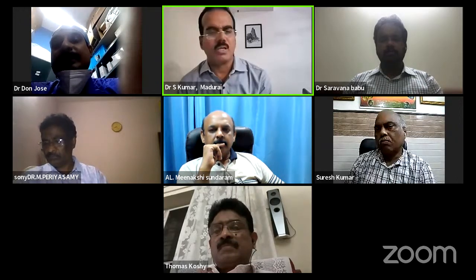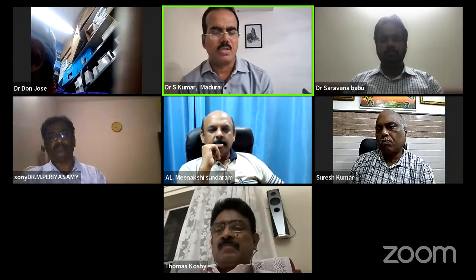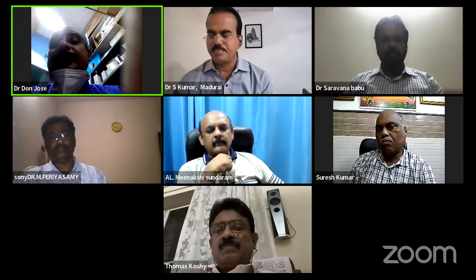Okay, another quick question. What about neuromonitoring in carotid endarterectomy? What are you following in Sri Chitra? We are following the use of NIRS, sir, regional cerebral oximetry. Okay.